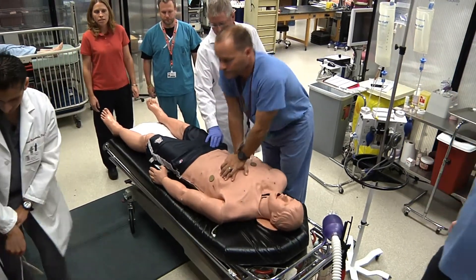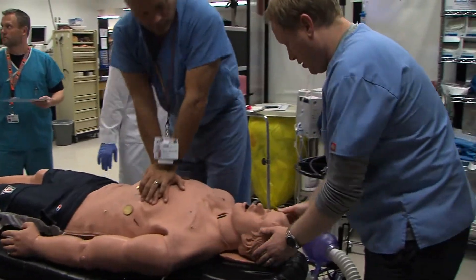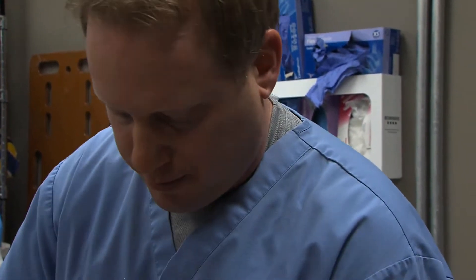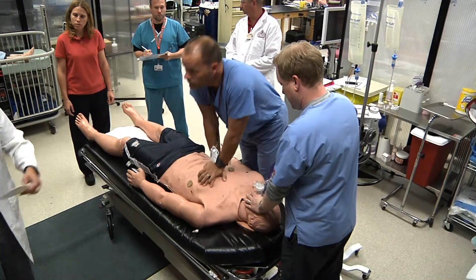I need someone to assess the airway and begin bag mask ventilation. Patient's not responding. I'll begin bag mask ventilation. I need someone to place a monitor. Monitor's being placed.